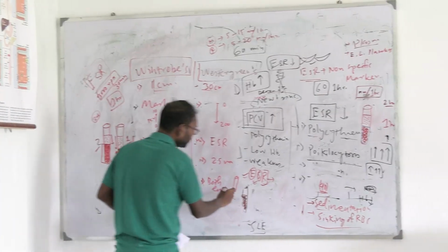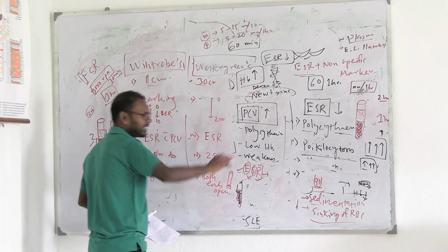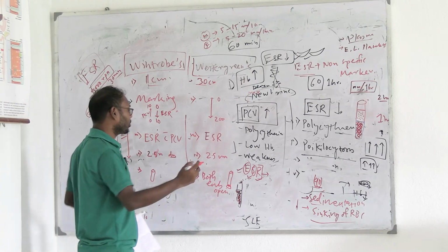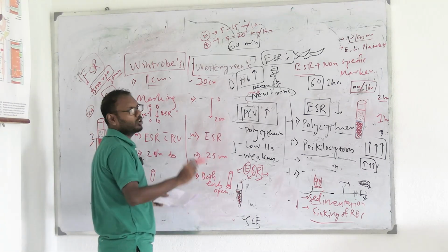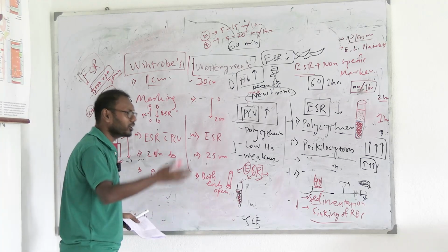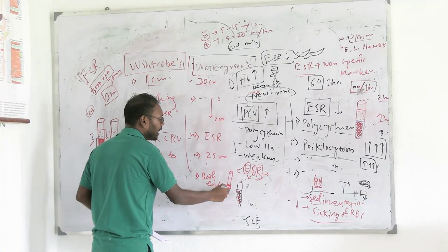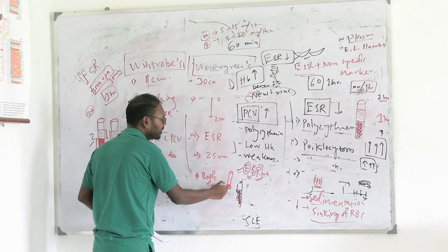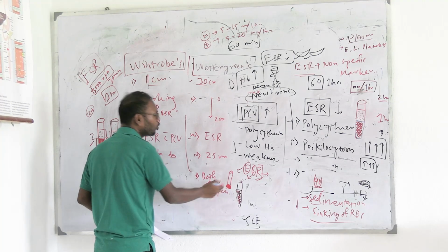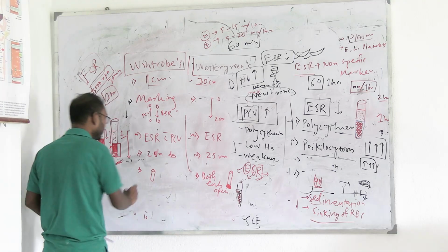Usually this end is protected by a cork. So যখন আমরা এটাকে সিস্টেমের বাইরে রাখছি, okay, their tubes are actually open. They are manufactured with both ends open, but when used in lab, for practical purposes, we have to have a rubber cork to close one end, so that the blood doesn't spill out. This is another difference.